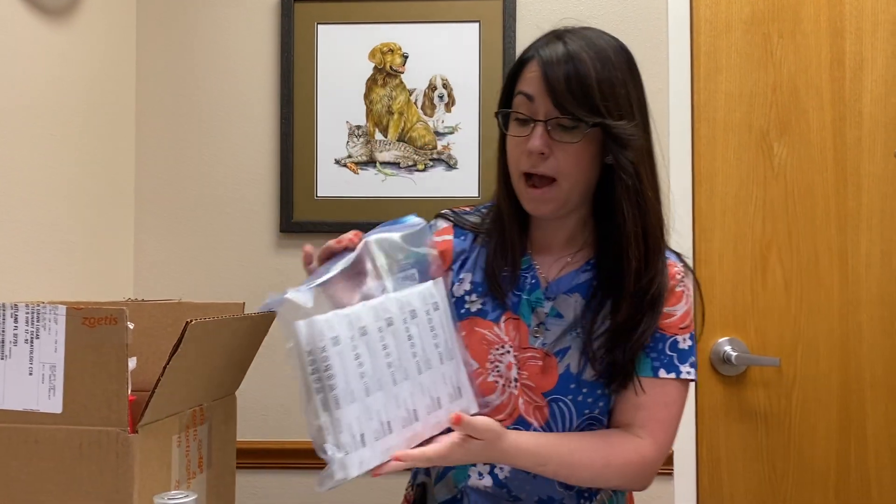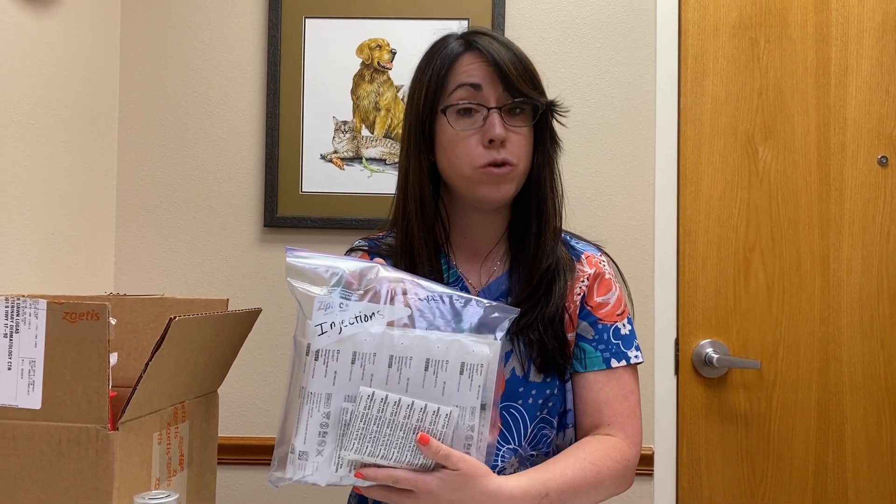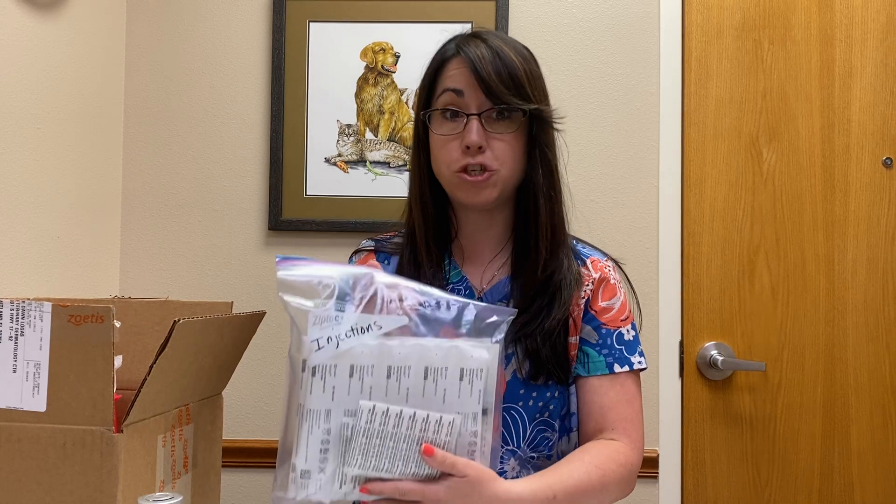You're going to have a full bag of syringes with needles and a separate set of needles, and that's because when you give the injection you're going to use a separate syringe and needle for each of the injections.